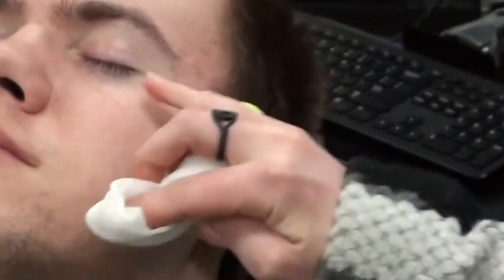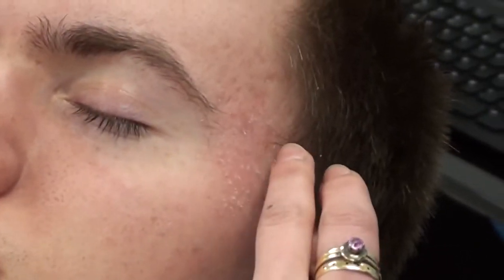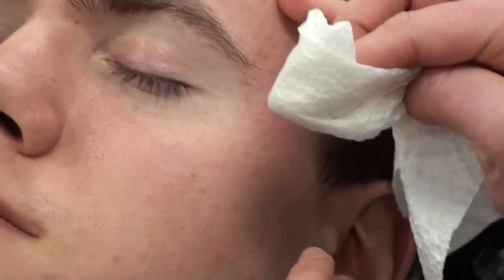When doing these side temple electrodes, we just go off to the side of the eye — not too high, not too low — so as to avoid the bones, but really into this divot on the temple.